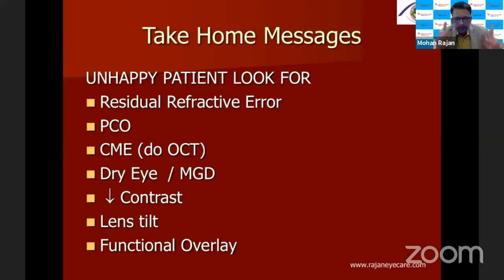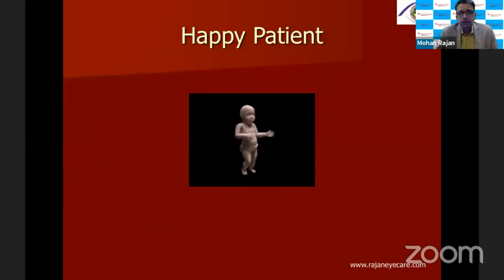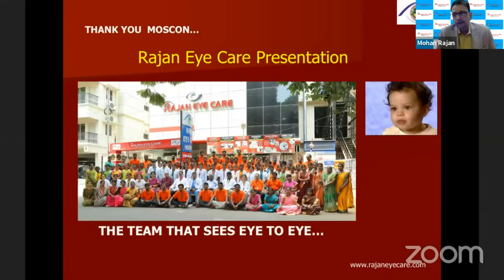Dry eye, ocular surface, look at the ocular surface. Decreased contrast because of glistenings is another important thing. Lens tilt, you have to take care and always do an eye trace preoperatively and postoperatively. And of course, keep the functional overlay as the last, the waste paper basket diagnosis. So this is a happy patient, and that's what we want at the end of it. Take care of all the parameters very strictly, preoperatively, intraoperatively, as well as postoperatively.